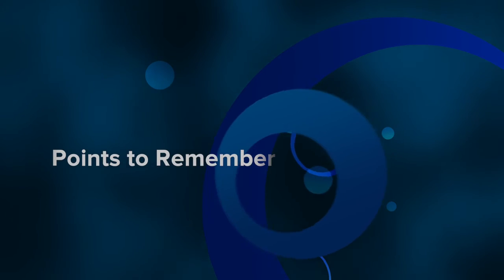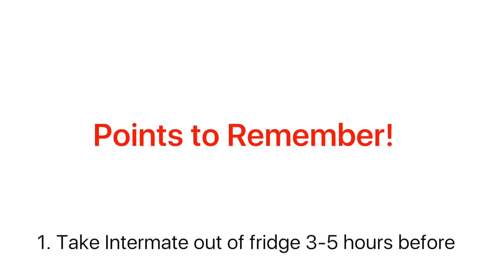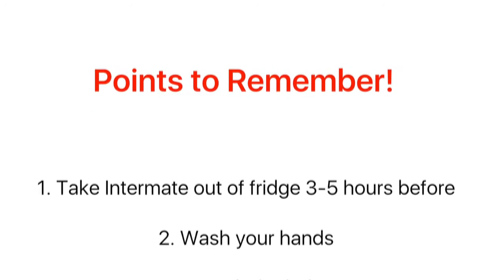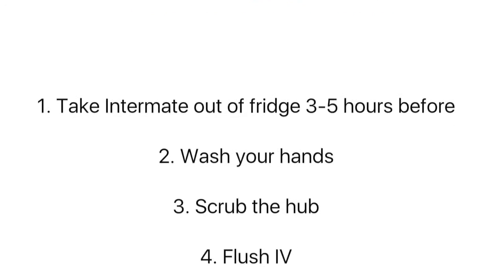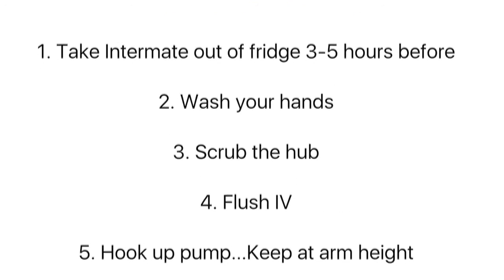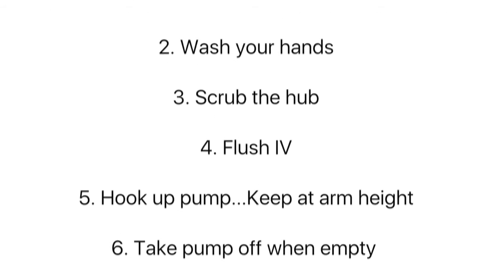Now let's look back at some of the key points you need to remember. You need to take the Intermate out of the fridge 3 to 5 hours before you hook up. Remember, you must always wash your hands before you touch your Intermate or any of your supplies. Always need to scrub the hub before you hook up or attach your flush. Then you need to flush your IV to make sure that your IV is working well. So check to see how easy it is to flush.